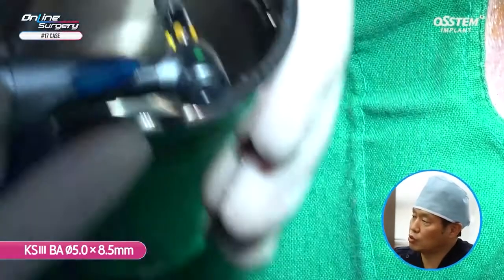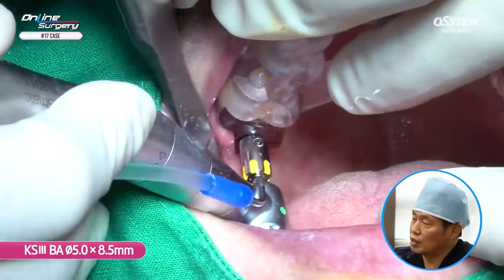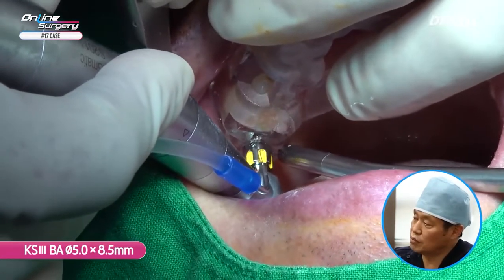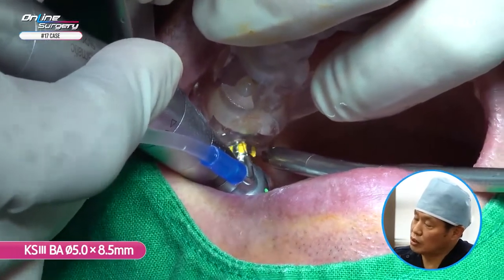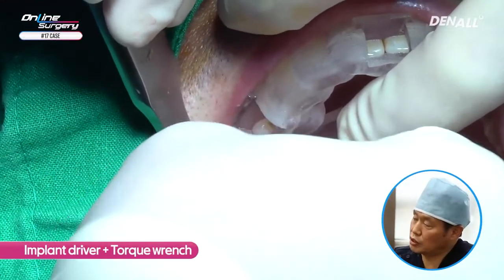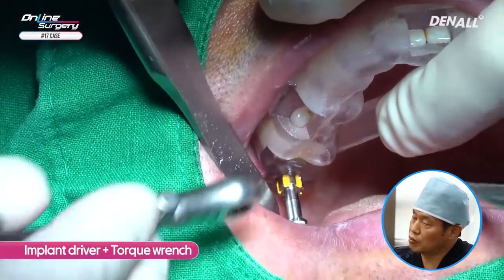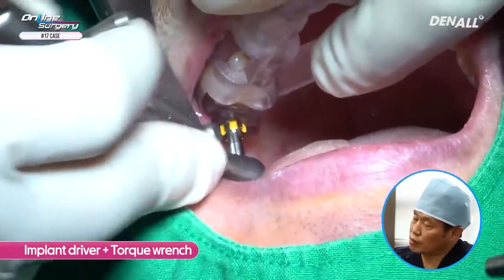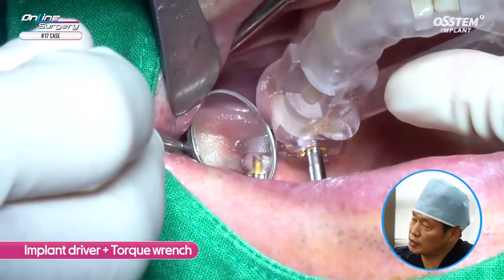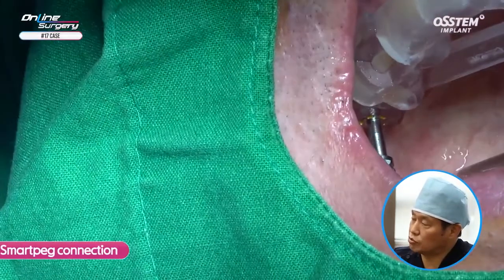KS-3 BA surface 5.0 by 8.5 implant is going to be placed. For the hydrophilic BA surface, you need to irrigate sufficiently before placing the implant — otherwise, if it contacts saliva, biofilm can form. I'm placing the implant with the engine up to approximately 80%, and then using the implant driver and torque wrench with tactile senses to finish placement. With the template on, I am installing the implant. Initial stability is sufficient, approximately 30–40 Ncm. Because the yellow of the template slot and the marking on the implant driver are aligned, the implant has been placed in the desired position.